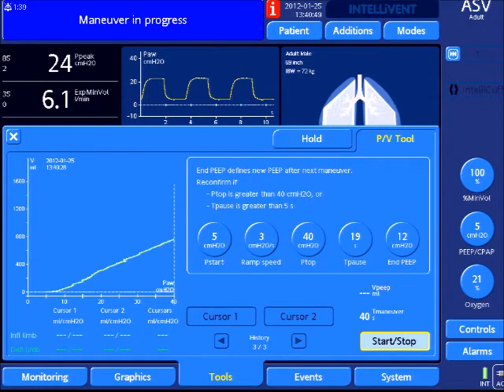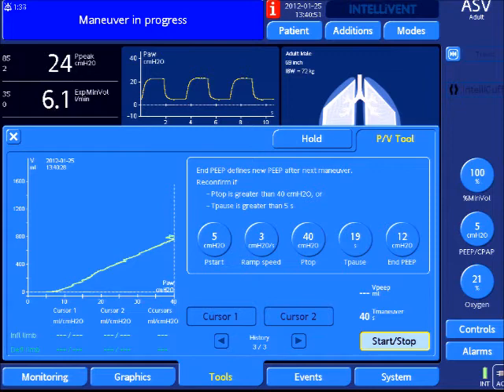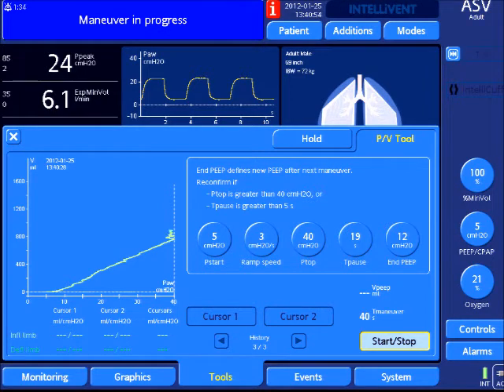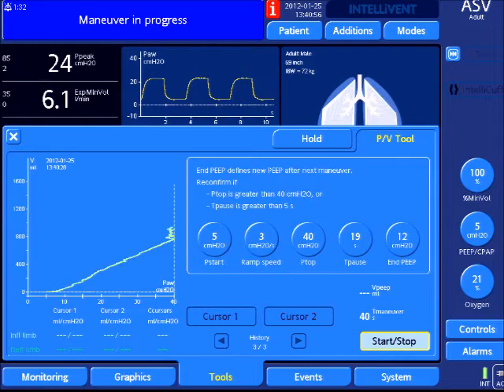Here's the maneuver that started, and now it's at the pause point. Let's see if the lung is able to recruit.